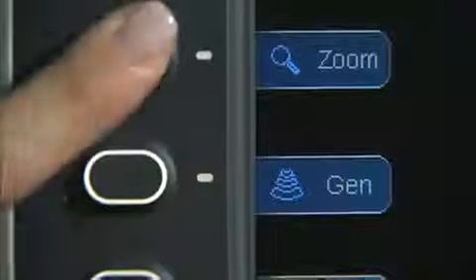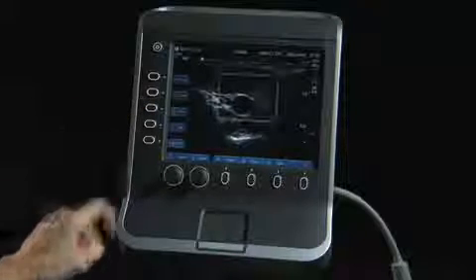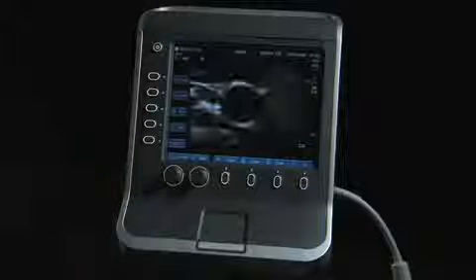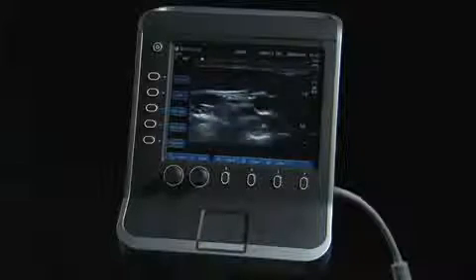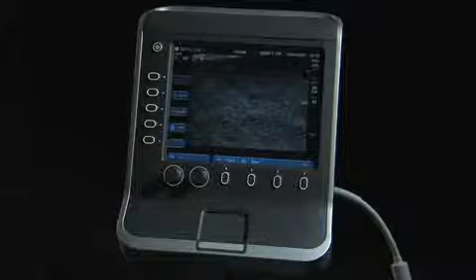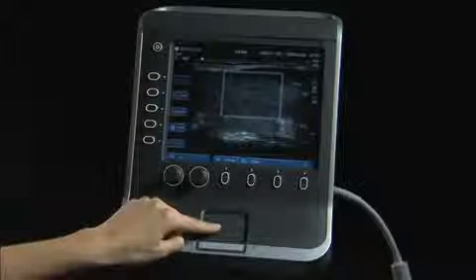Zoom magnifies the image by a factor of 2. Press once to choose the region of interest. Use the touchpad to position the region of interest box within the image. Press the Zoom key again to magnify the area of interest. Press the Zoom or the 2D key to exit. The Zoom key feature is also available on a frozen image. Press the Zoom key to activate and the touchpad to pan the image to the area of interest.